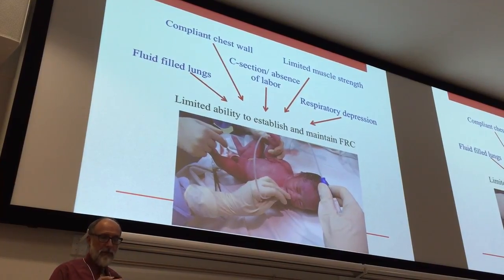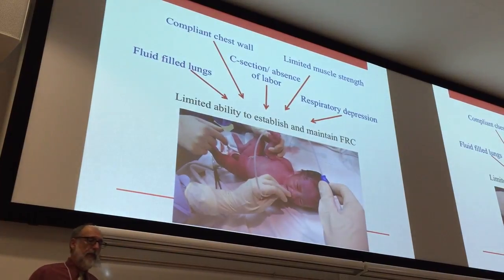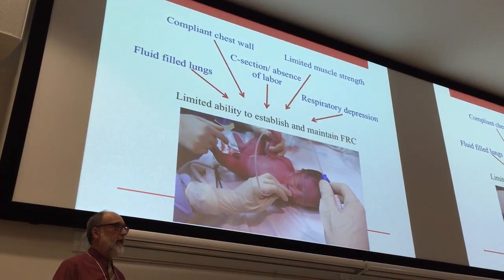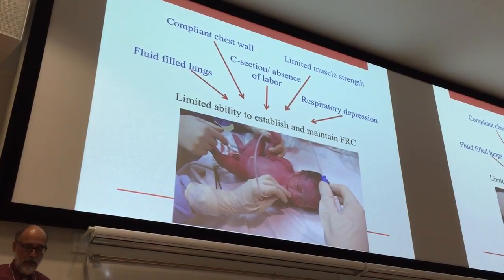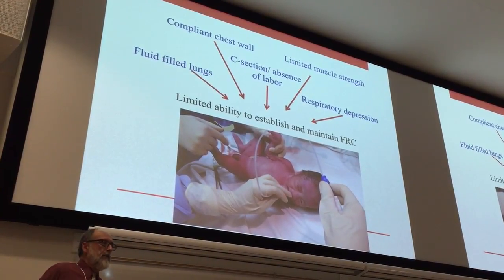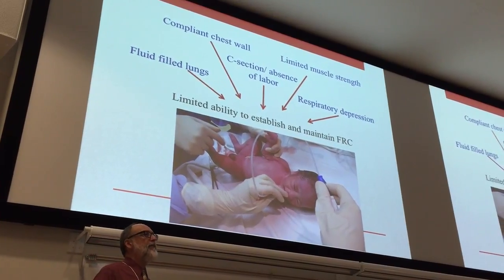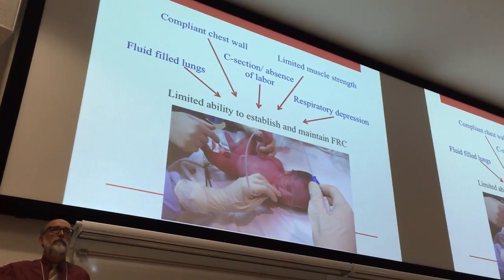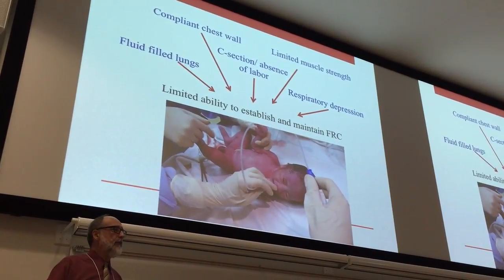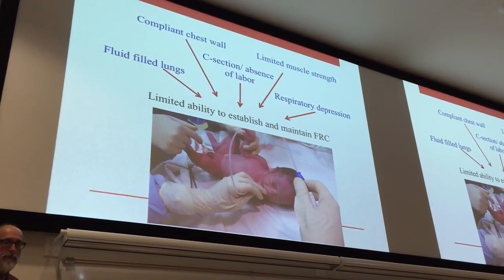And there's much interest in sustained inflation, and Georg and his group here are involved in the SAIL trial that is looking at whether sustained inflation in the delivery room is the right recipe for dealing with this. The same sustained inflation may not have the same benefits later on. We don't know. Some people do use sustained inflation to recruit lung volume at 2 days of age or 12 hours of age. That may or may not be the same result.